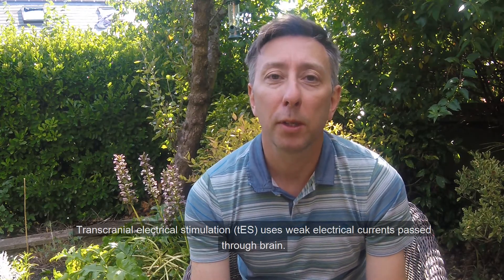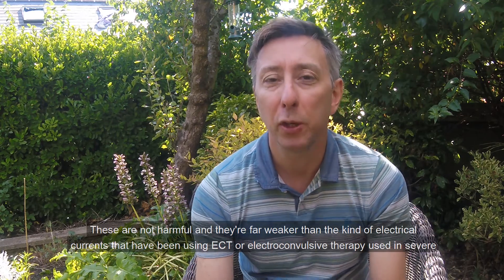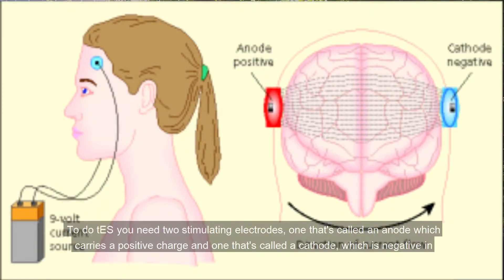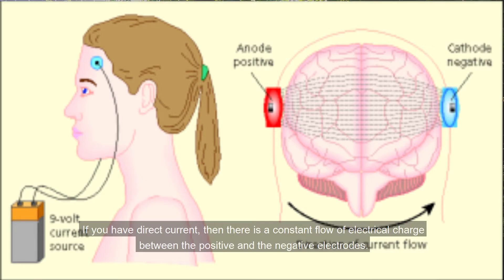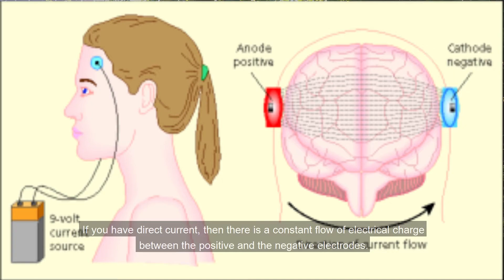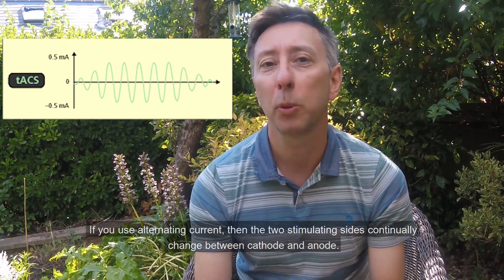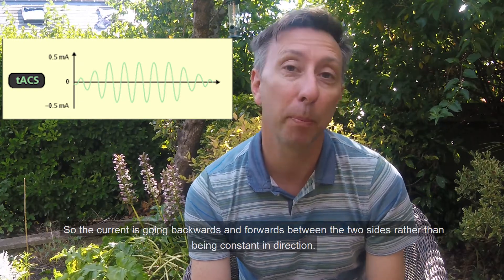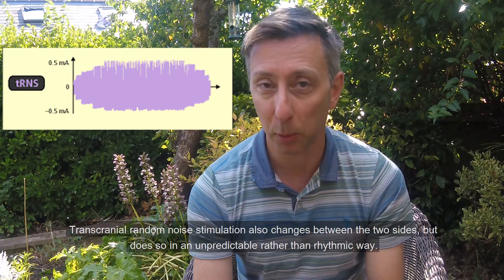Transcranial electrical stimulation, or TES, uses weak electrical currents passed through the brain. These are not harmful and are far weaker than the currents used in ECT — electroconvulsive therapy — for severe depression. To do TES you need two stimulating electrodes: an anode, which carries a positive charge, and a cathode, which is negative. With direct current there's a constant flow between the positive and negative electrodes. With alternating current the two sites continually switch between cathode and anode, so current flows back and forth. Transcranial random noise stimulation also switches between the two sites but does so in an unpredictable rather than rhythmic way.